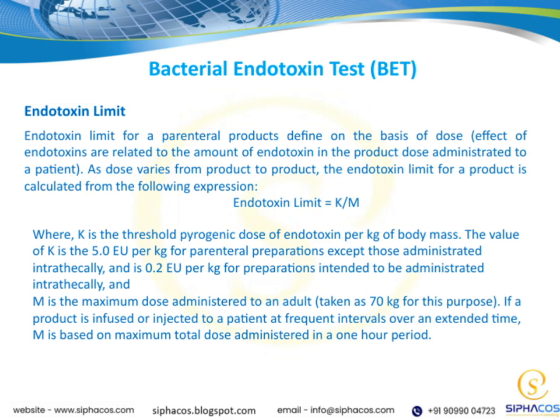This helps us understand that the endotoxin limit for a product depends directly on the dose. Since the effect of endotoxins correlates with the amount present in the administered dose, calculating the limit involves dividing K by M. So, the endotoxin limit essentially tells us the maximum allowable endotoxin level in a product, ensuring safety based on how much of the product is used.